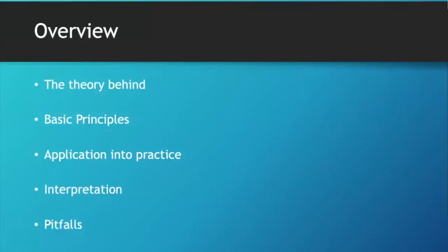What we're going to try and cover is what's the theory behind ST, what's the whole idea behind ST, and what are the basic principles. Okay. Then how do we apply this into practice? How do we interpret them? And the pitfalls that we can fall into. The pitfalls part is going to be more of a discussion than any screen or slides. Okay. Let's start off with the basic bit of theory behind.